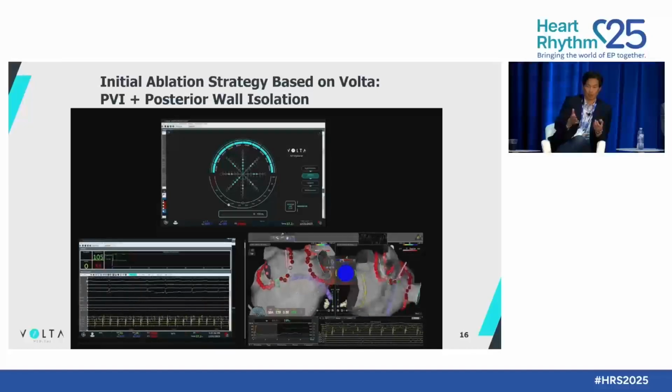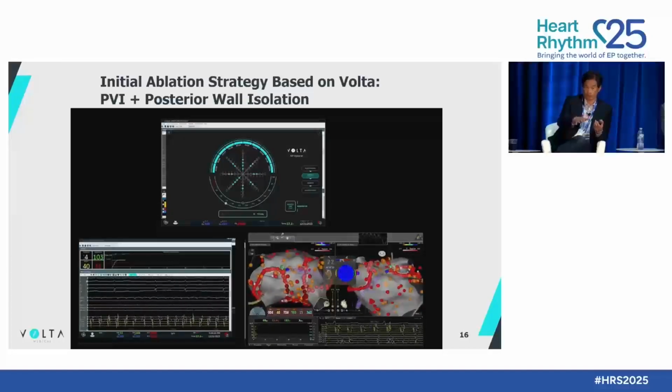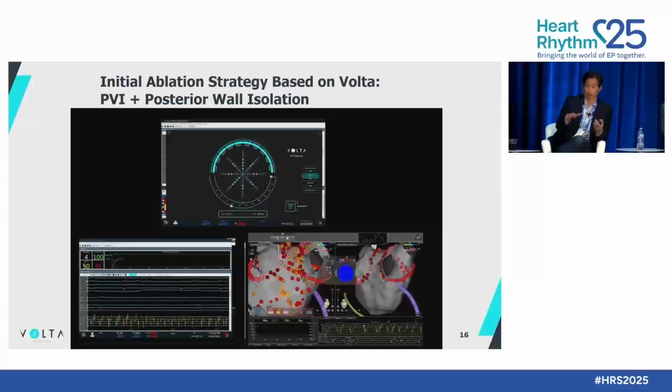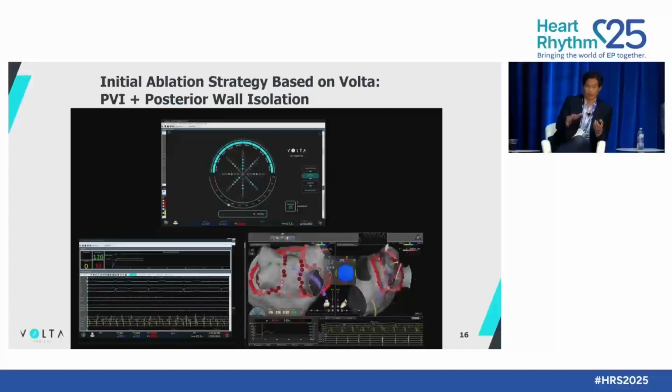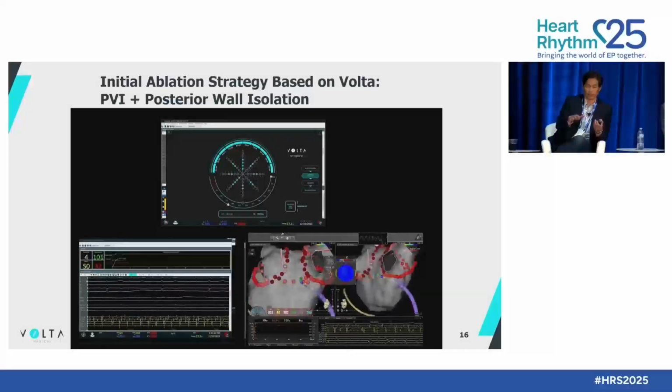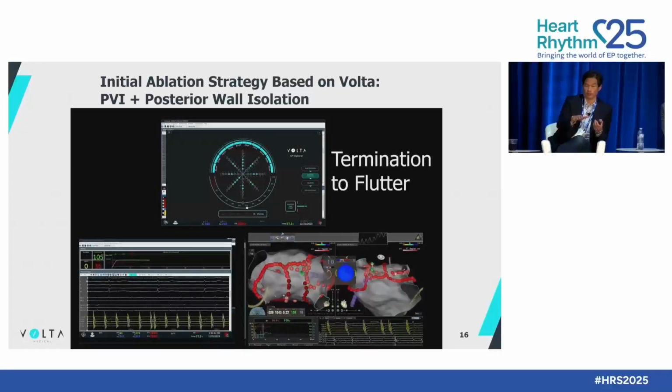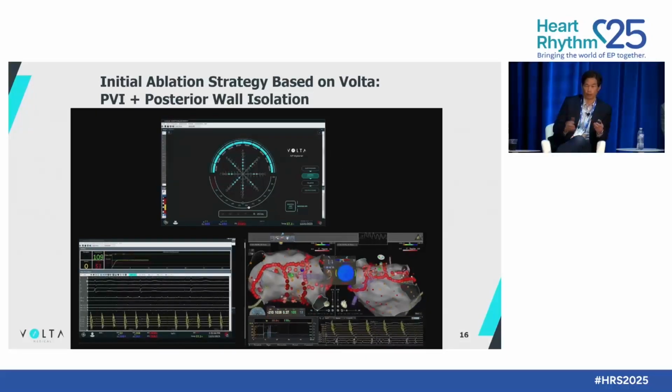quite organized, but you see some slowing if you look carefully at the electrograms that are shown on the CS catheter. And then as we start ablating the posterior wall that I decided to target, you'll see, if I can have a few extra seconds, eventually this will now organize into a flutter right there. And so then, that's great. So again, not a surprise anymore, frankly, and this is sort of what we expect to see.